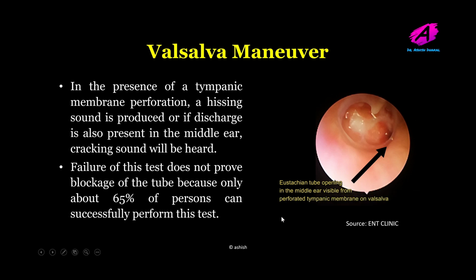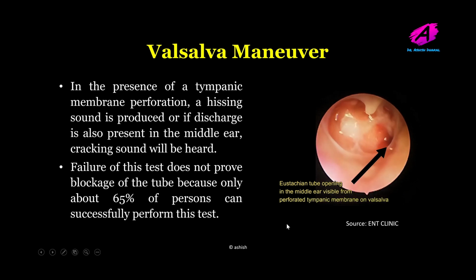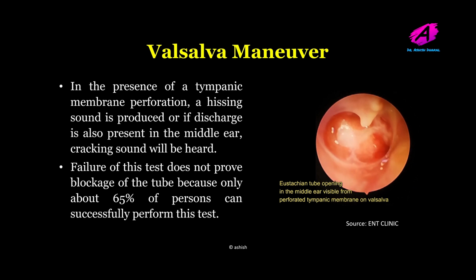Here you can see a perforation in the tympanic membrane. There is some discharge here. As the person is doing the Valsalva maneuver, you can see bubbling through the area of opening of the Eustachian tube, in the case of perforation of the tympanic membrane.